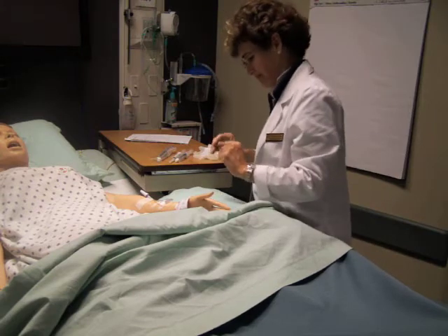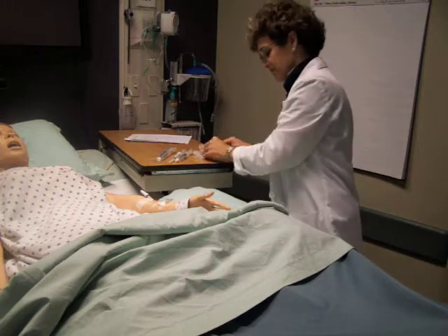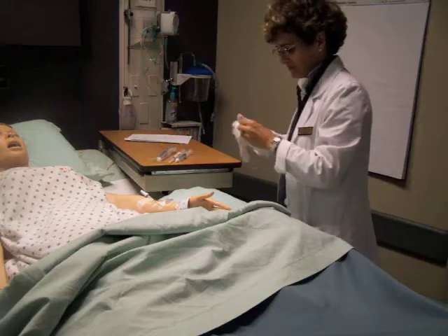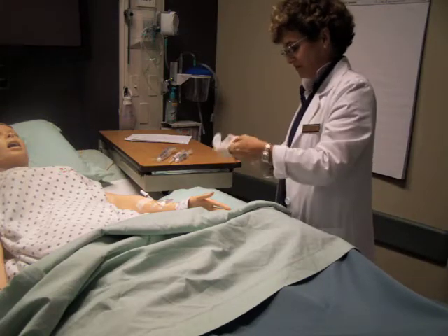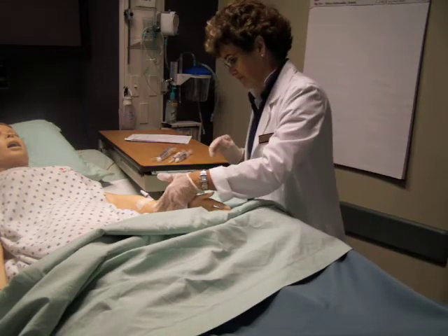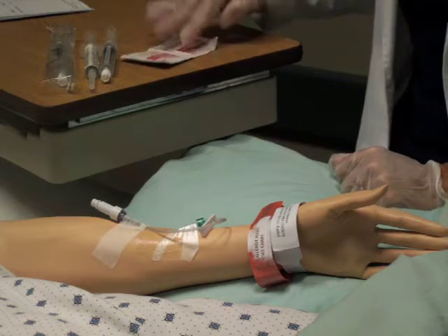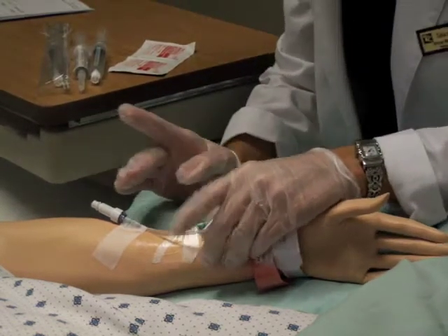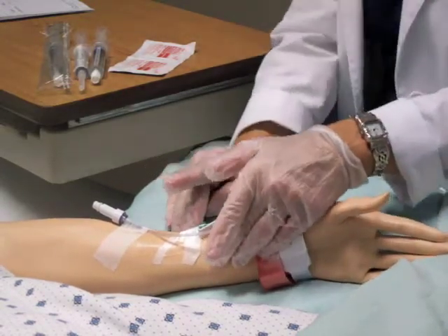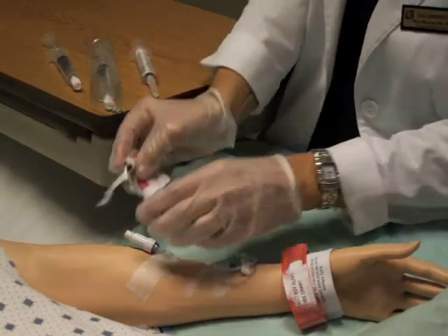Apply clean gloves, which reduces transmission of microorganisms and risk of blood exposure. Inspect and palpate the IV site for signs and symptoms of infection, infiltration, phlebitis, or dislocated catheter. Clean the injection port thoroughly, 6 seconds, with an alcohol swab.